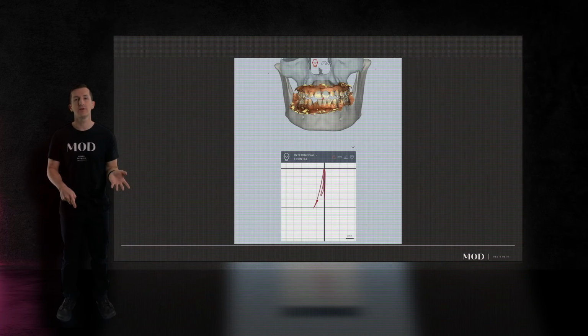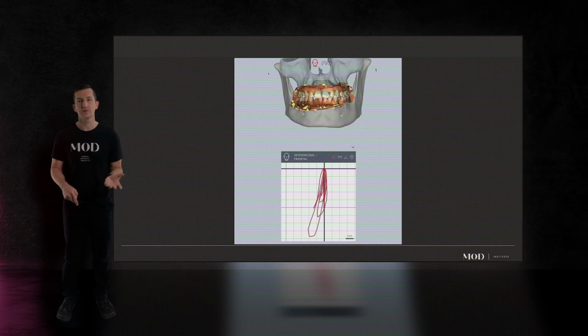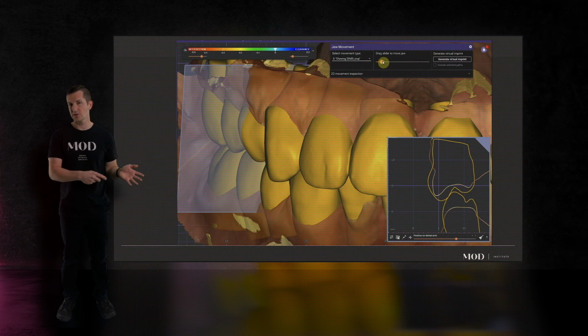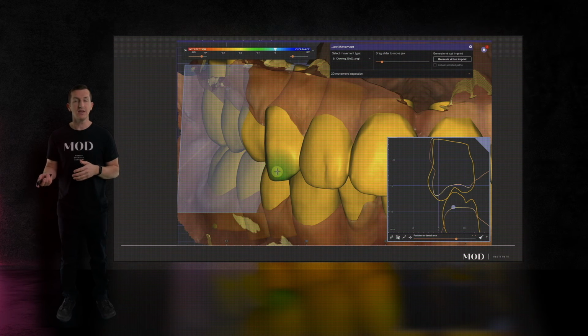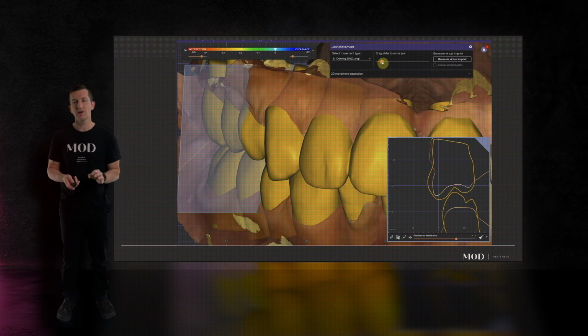The other thing that we can record and plan for is true masticatory function, where we're recording these chewing strokes. We're going to take them straight into our digital design software, and then we're able to harmonize the position and the size and shape of those posterior cusps so that for patients who don't need any type of chewing function rehabilitation, we can have our restorations completely in harmony with their learned chewing motions so that the level of adaptation needed is very, very minimal.